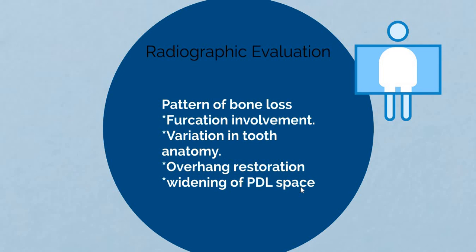The panoramic radiograph, particularly if obtained using a modern machine, is an alternative to full mouth periapical radiography. So if you don't have the time or a machine for taking 14 x-rays, which is a full mouth radiograph, by taking a high quality OPG, it will help us as a full mouth radiograph.